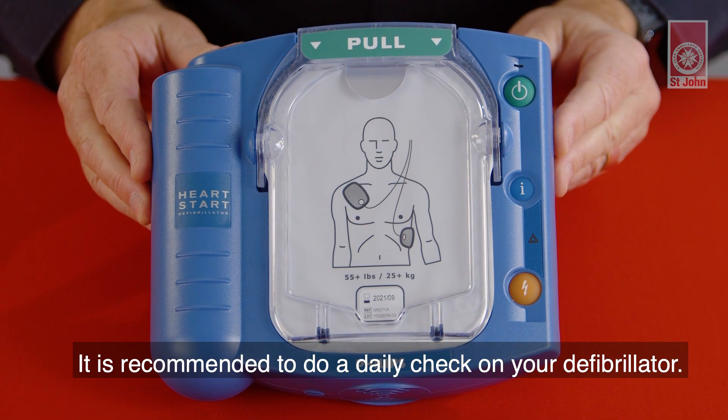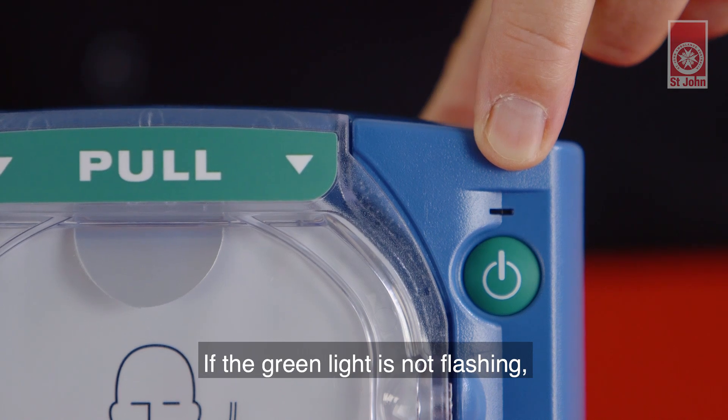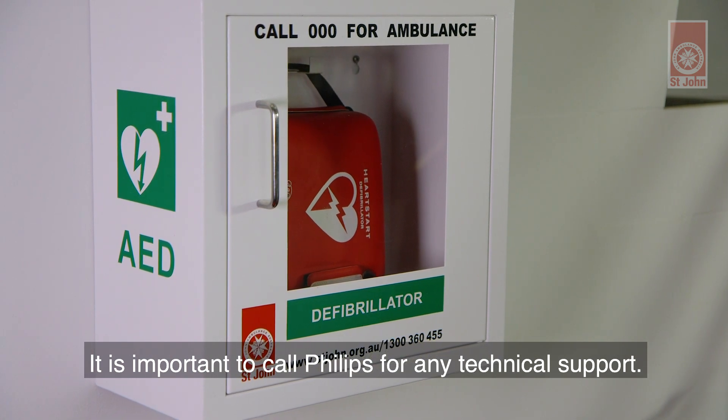It is recommended to do a daily check on your defibrillator. If the green light is not flashing, it could mean something is wrong with your unit. It may not be first aid ready. It is important to call Philips for any technical support.